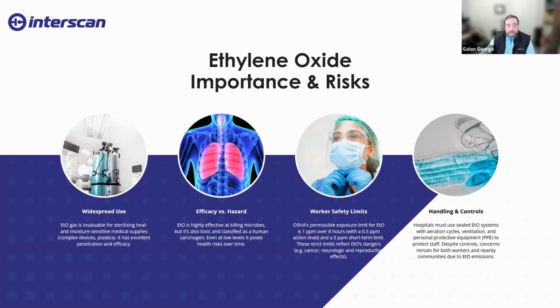Despite all this, ethylene oxide has been in the spotlight because emissions from sterilization facilities have, in some cases, impacted surrounding communities. And you may have even seen in the news sterilization plants being temporarily shut down due to local air pollution concerns. So ethylene oxide's importance to healthcare is huge, but so is the imperative to handle it with extreme care.